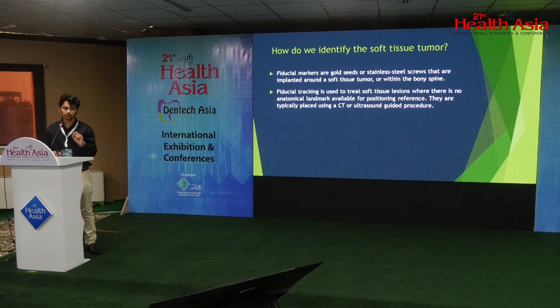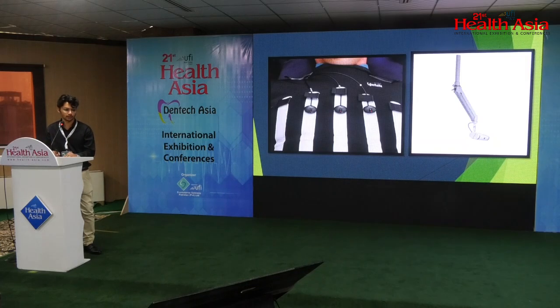So these gold markers are implanted inside the patient's body around the soft tissue in close proximity to the tumor. So in whatever axis the tumor moves, the markers also move, and these markers are completely in sync with the motion of the tumor. These markers are implanted using CT or ultrasound guided procedures.